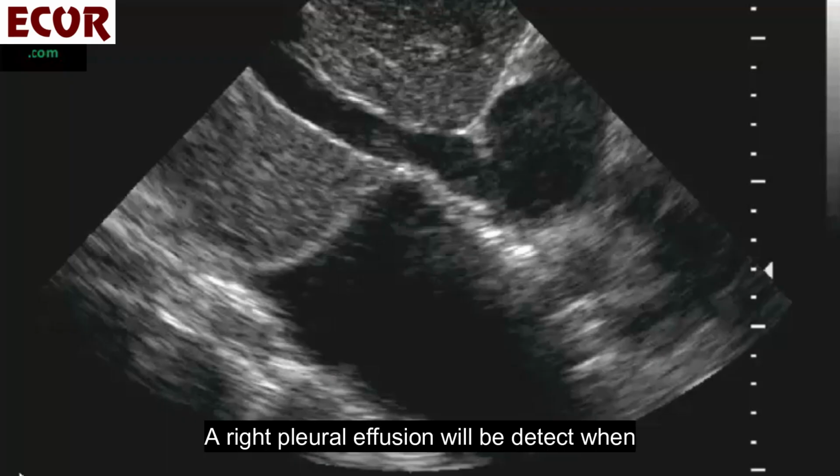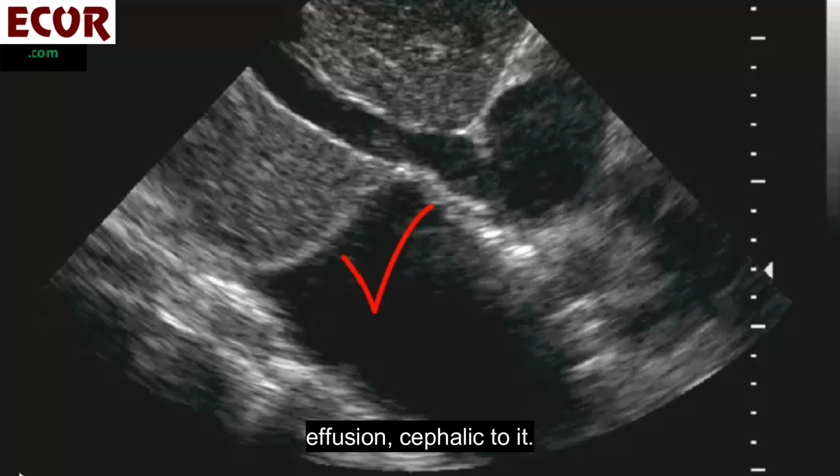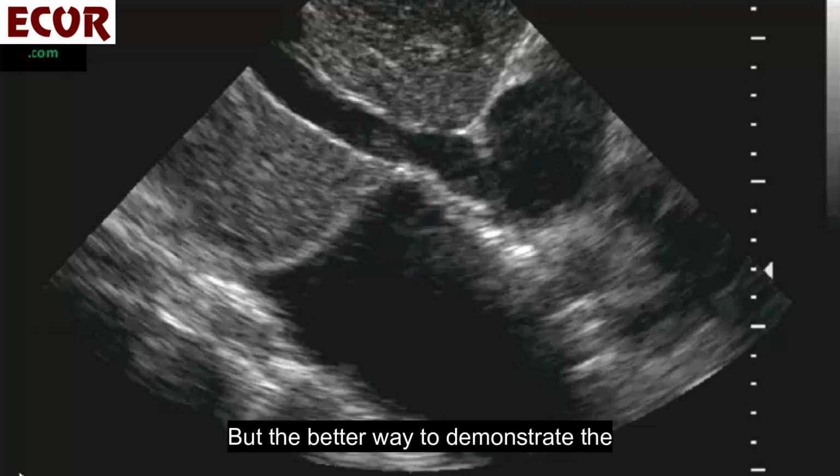A right pleural effusion will be detected when, during a long X of the epigastrium, we see the liver, the diaphragm and the effusion cephalic to it. But a better way to demonstrate the presence of a right or left pleural effusion is to sit up the patient and scan his left and right back from the abdomen to the lungs.